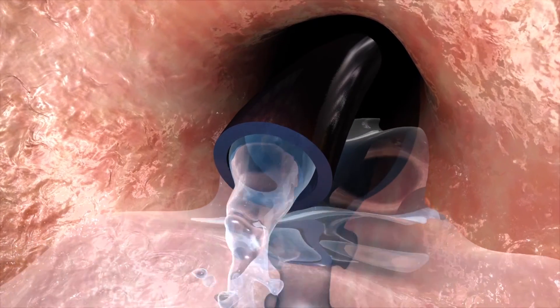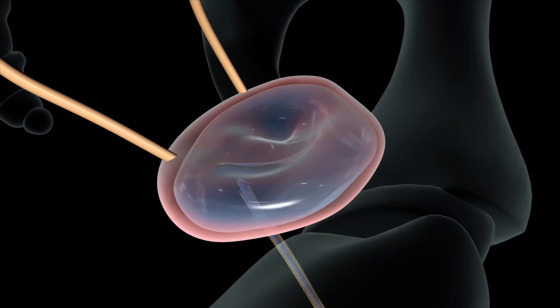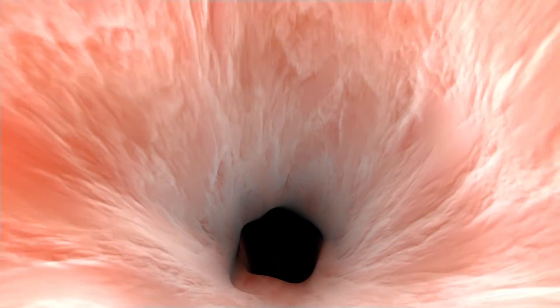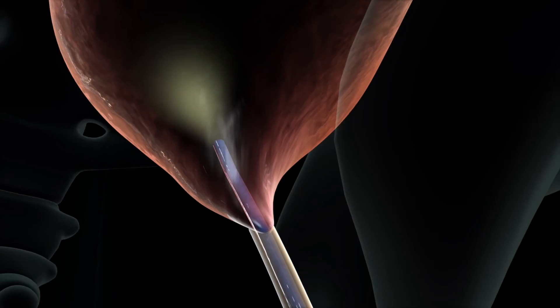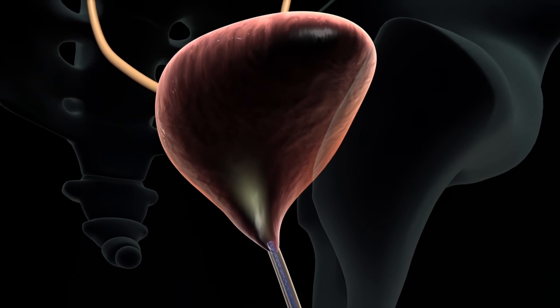By introducing a clear, sterile solution, your doctor will expand the bladder. He or she will carefully examine the lining of the bladder and urethra by looking through the eyepiece on the cystoscope, as well as by viewing images projected onto the video screen. When your doctor is finished, the scope will be removed.